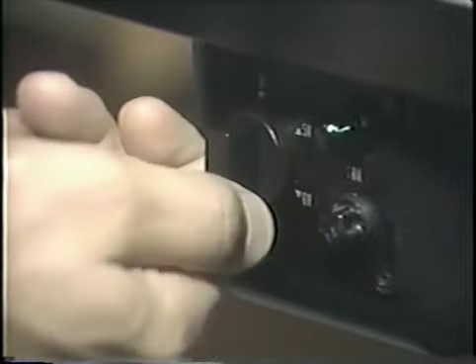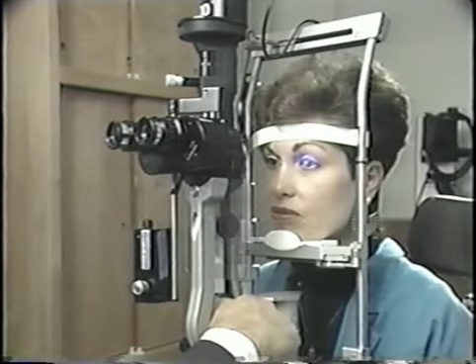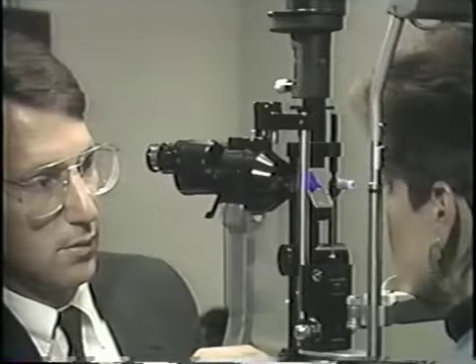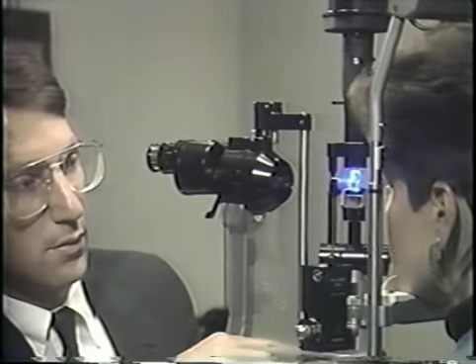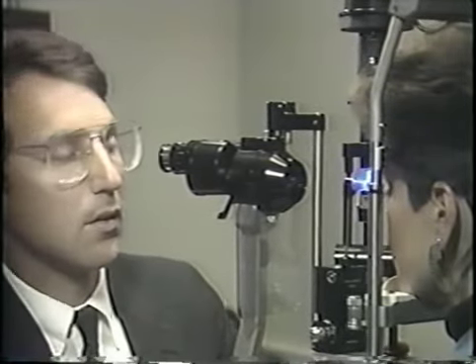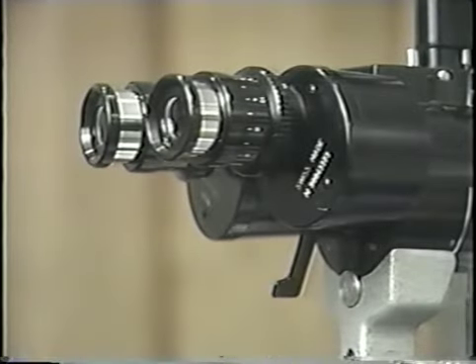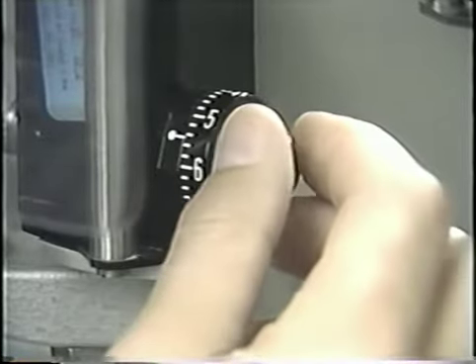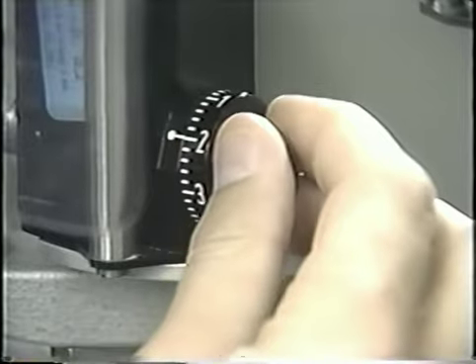After the slit lamp is turned on to its highest level of illumination, the cobalt blue filter is put into place, and the slit opened to its widest position to achieve the brightest light. The angle between the illumination device and the biomicroscope should be about 60 degrees to best illuminate the tip of the prism. Low magnification oculars are preferable. With many patients, it helps to preset the tonometer at 20 millimeters of mercury so that less adjustment will be necessary for the specific measurement.